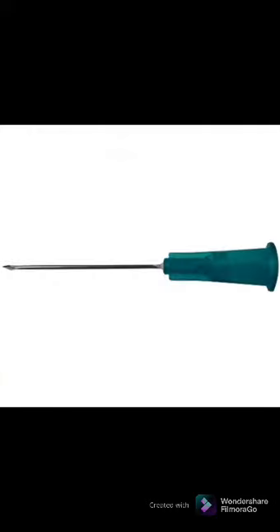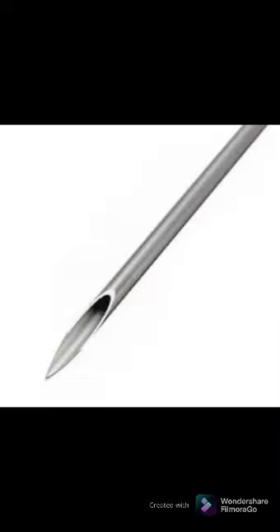The 22 gauge is also known as the multi-sample hypodermic needle. This is used on older children and adults with small veins or difficult veins. And lastly, we have the 23 gauge. This is known as the butterfly needle, and it is used for veins on infants and children and adults with difficult veins.